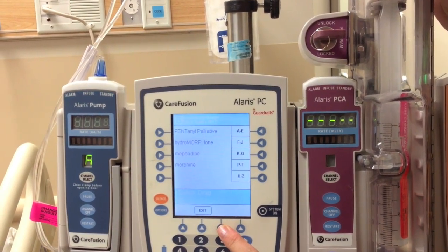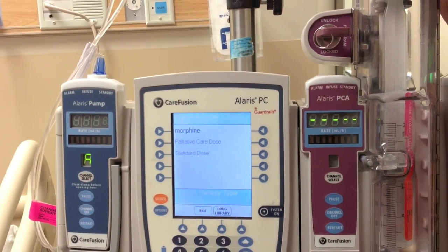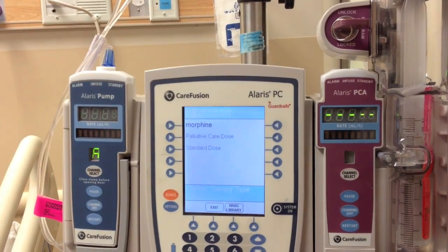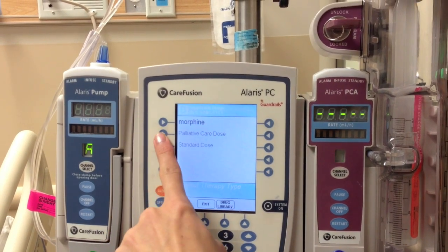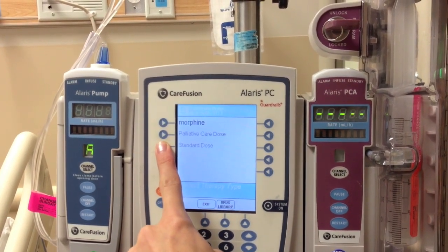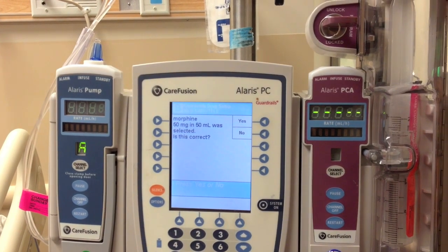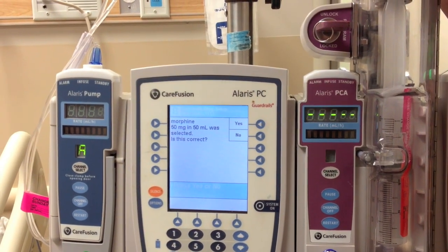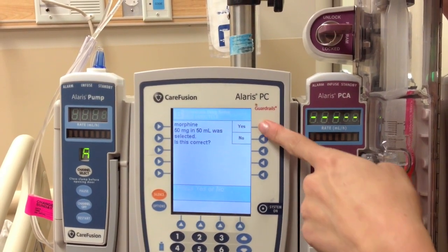Select the syringe and select the drug that you will be infusing. Choose the standard dose and confirm that this is the right drug with the right dose within the syringe.